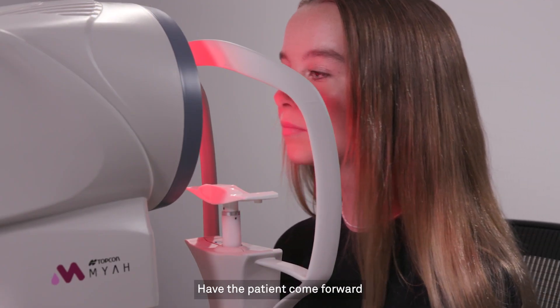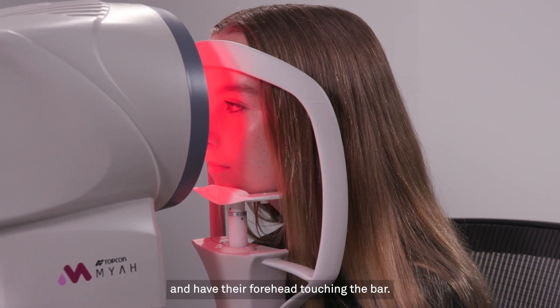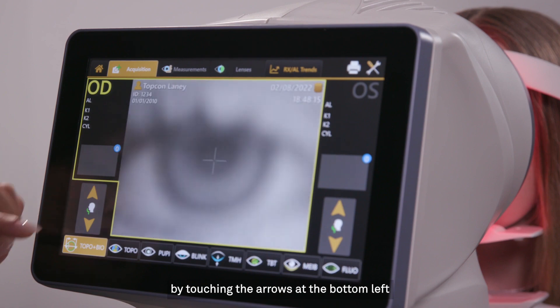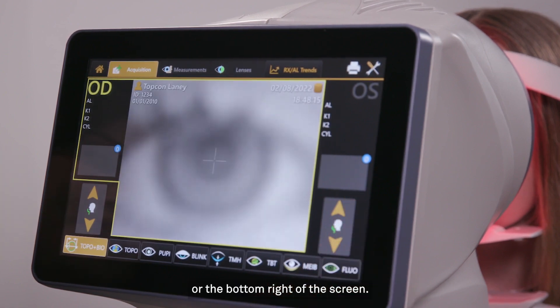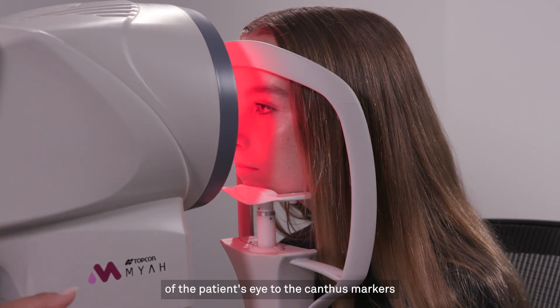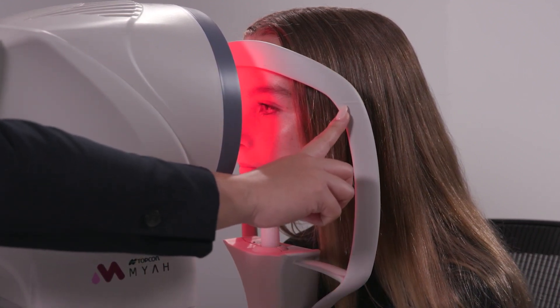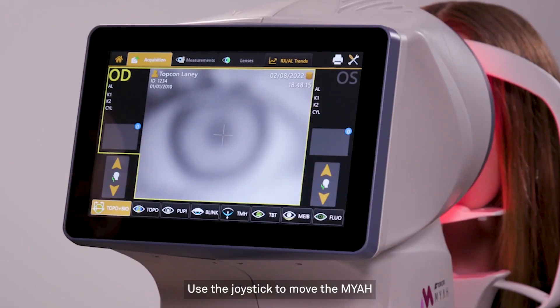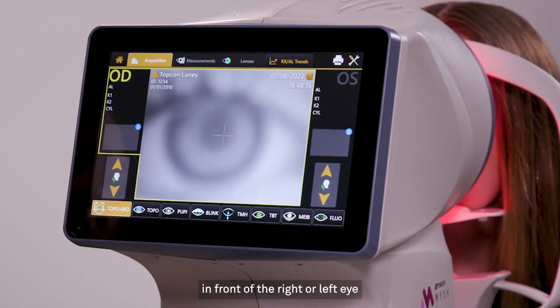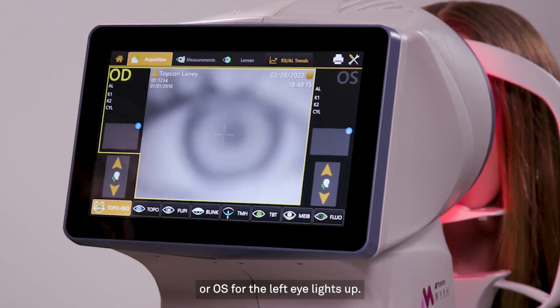Have the patient come forward and place their chin on the chin rest and have their forehead touching the bar. You can move the chin rest height by touching the arrows at the bottom left or the bottom right of the screen. You want to align the outer corner of the patient's eye to the canthus markers on the forehead rest of the Maya. Use the joystick to move the Maya in front of the right or left eye until OD for the right eye or OS for the left eye lights up.